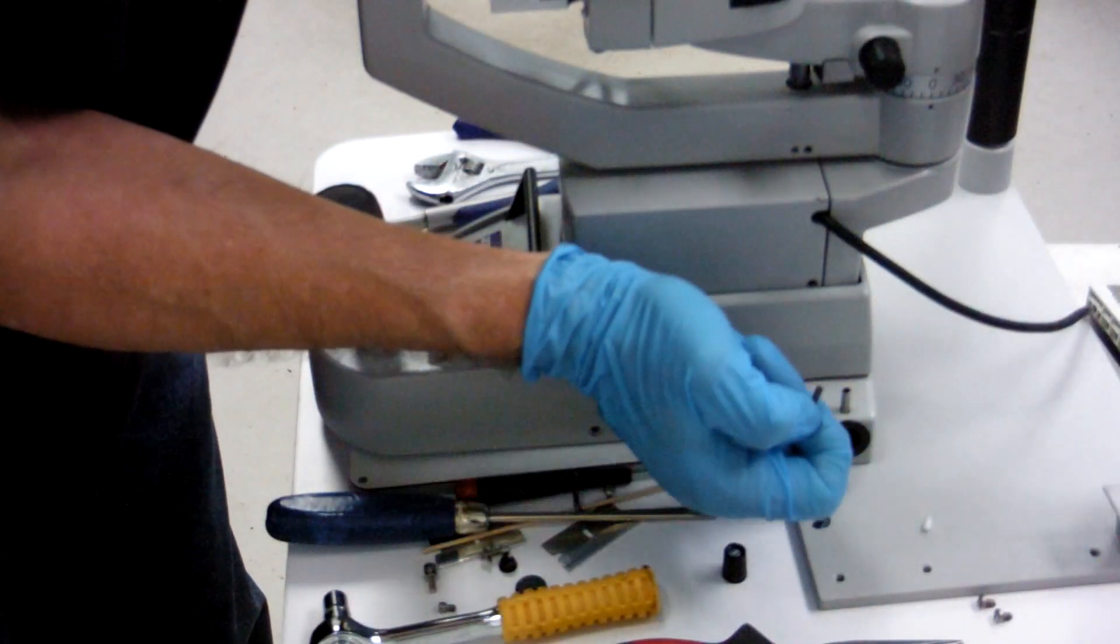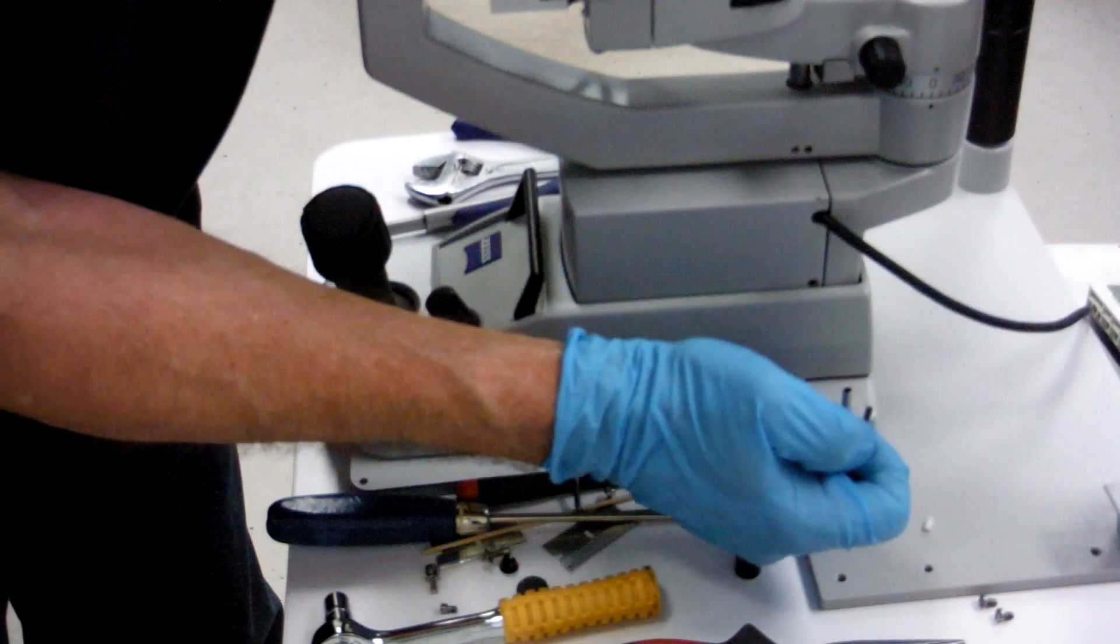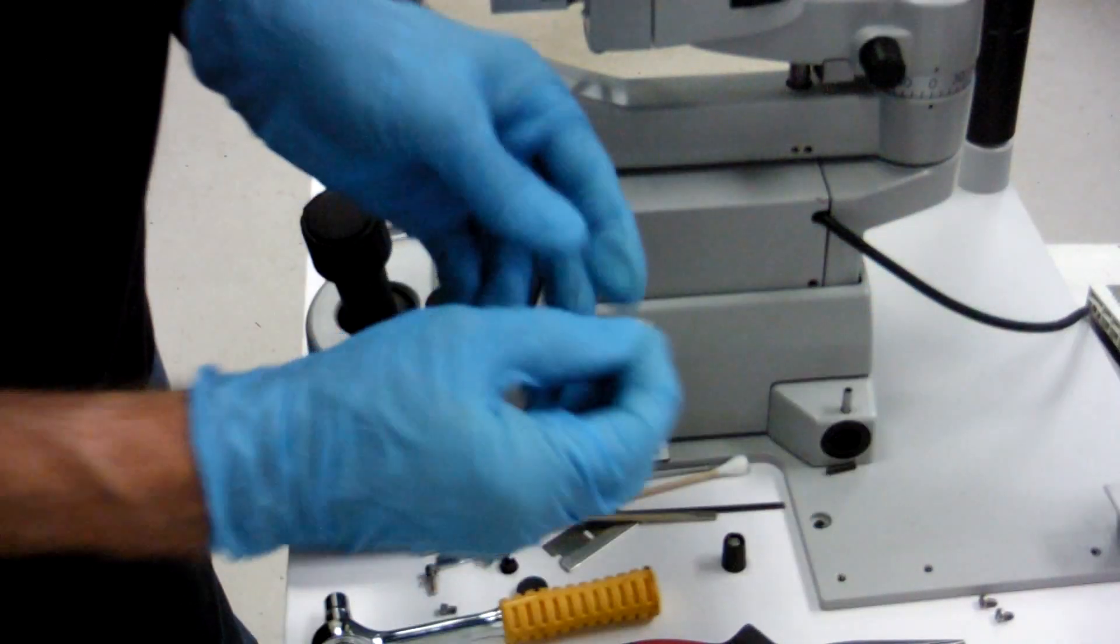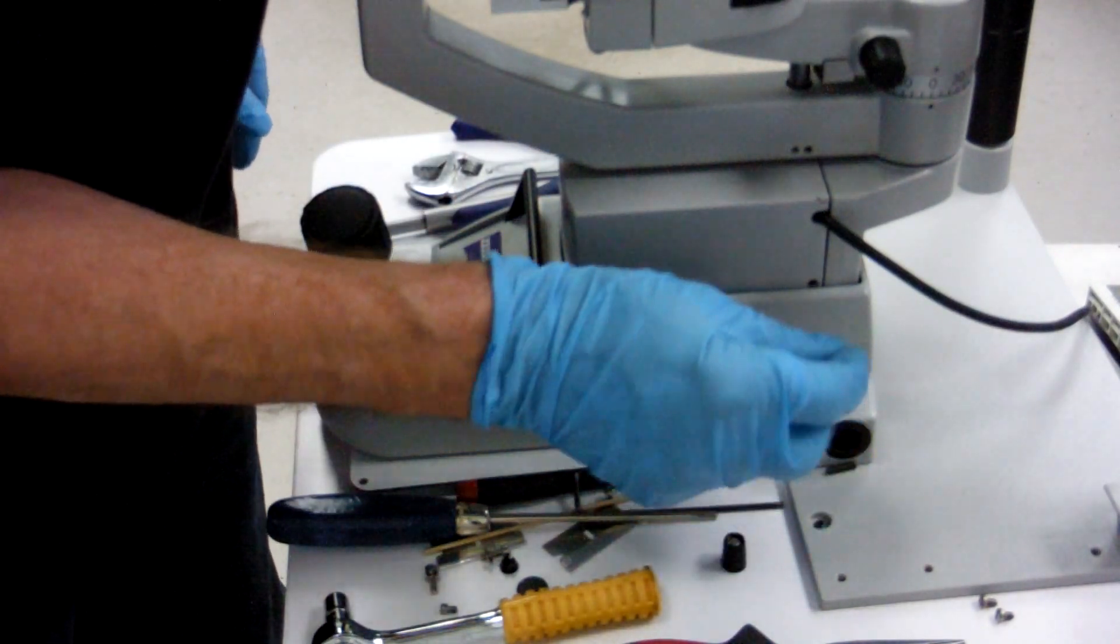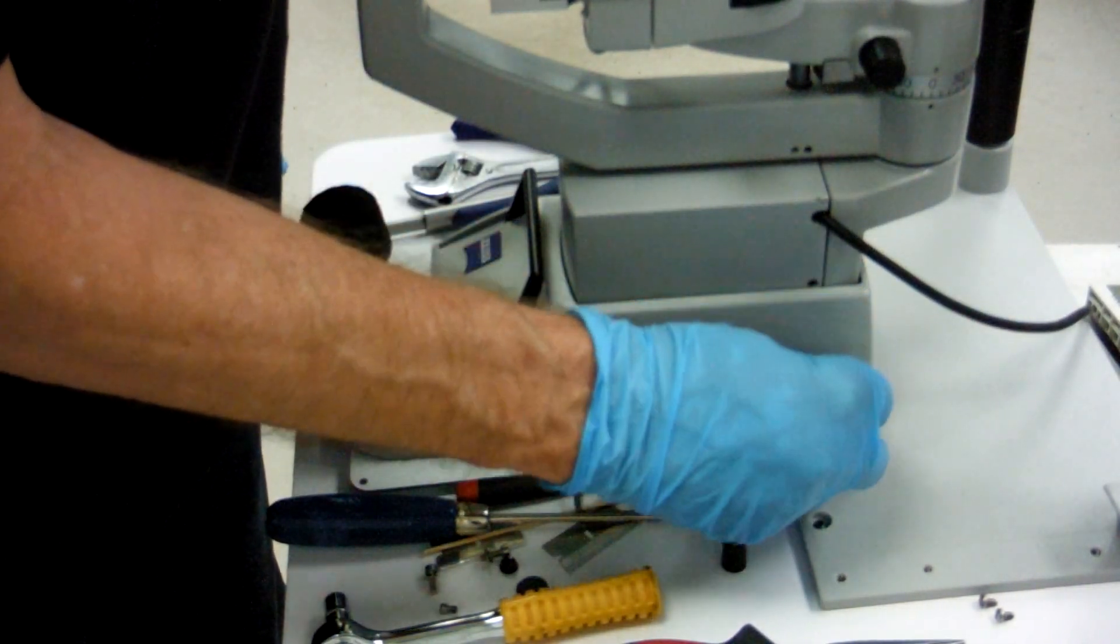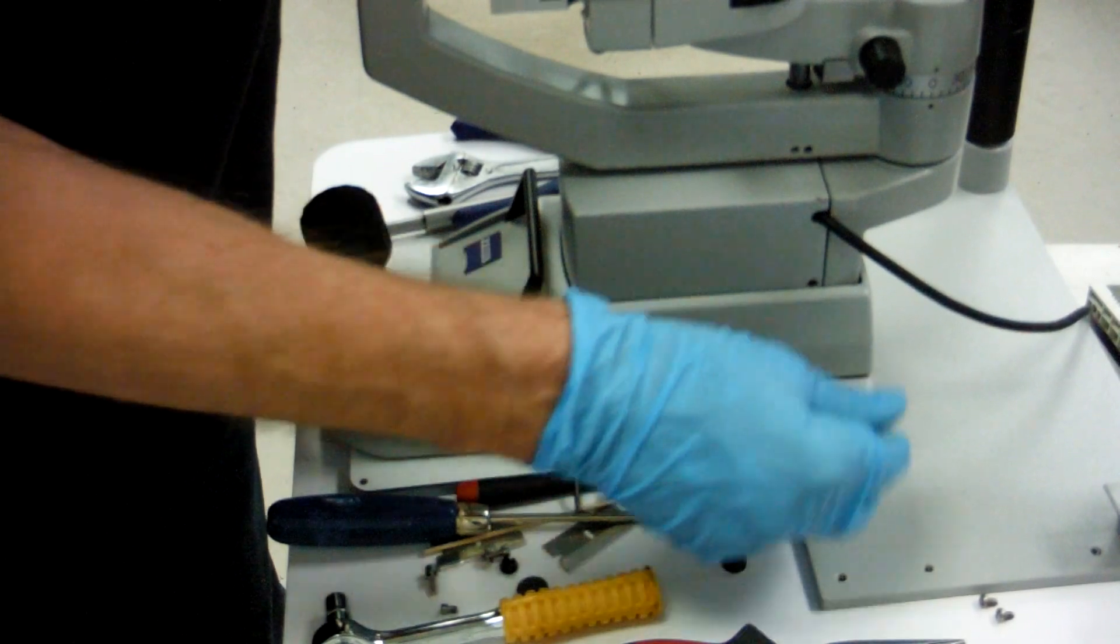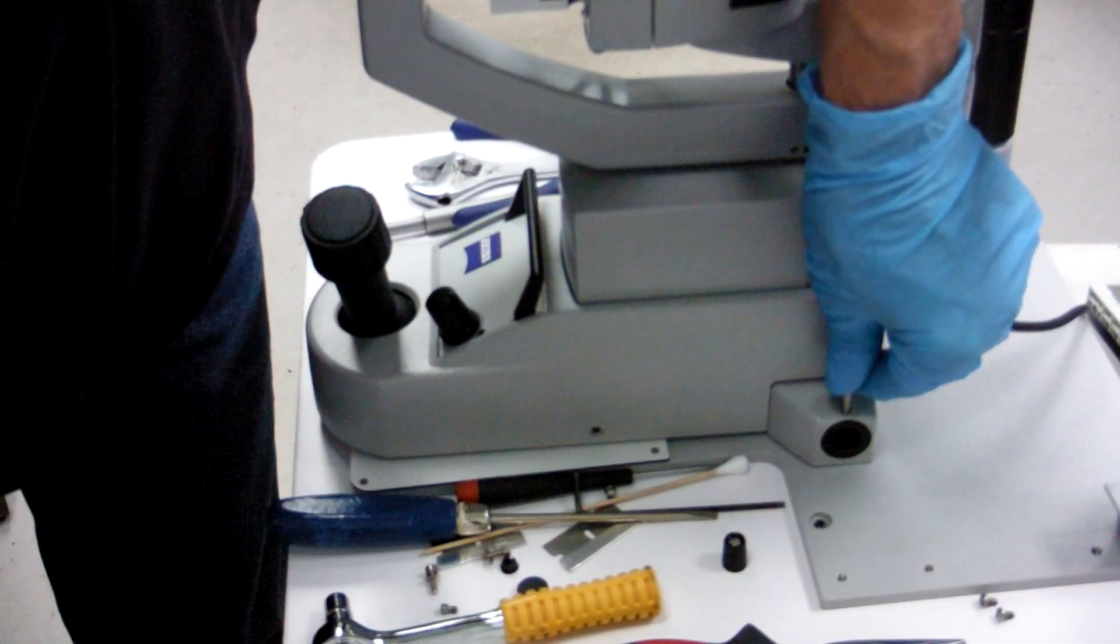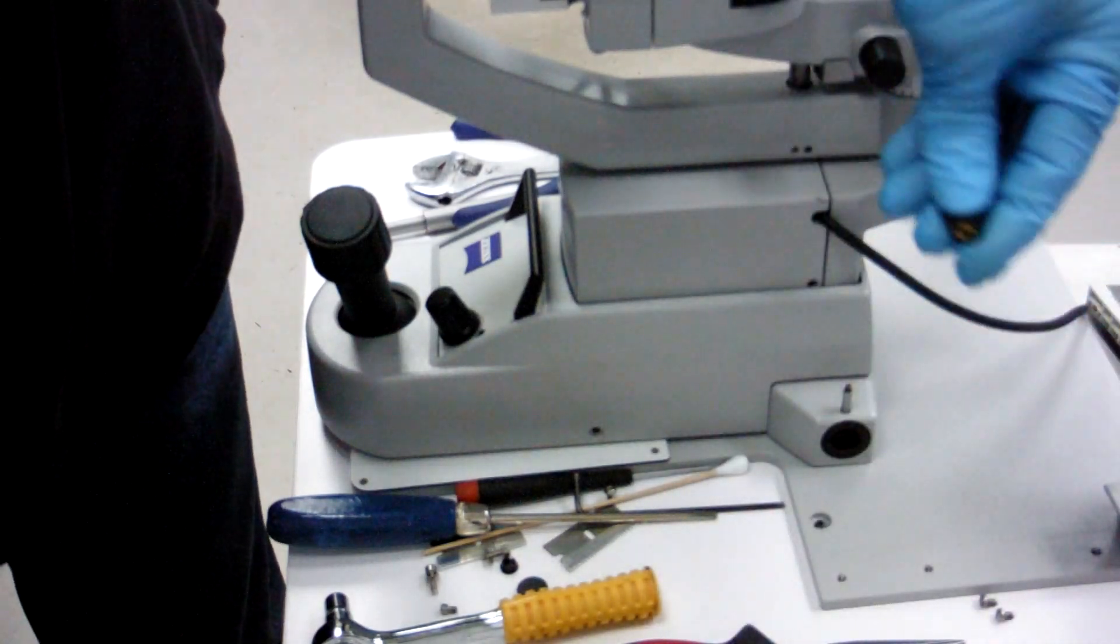You could put your screw on the bottom of it first to hold it in place. Put your plunger, the little end in first. Spring. And then your knob.